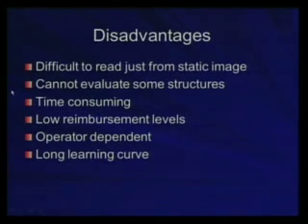The disadvantages of ultrasound are that it's difficult to read just from a static image, it cannot evaluate some structures, it is time consuming, it has low reimbursement levels, it is operator dependent, and it has a relatively long learning curve.